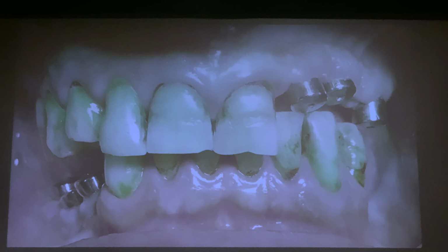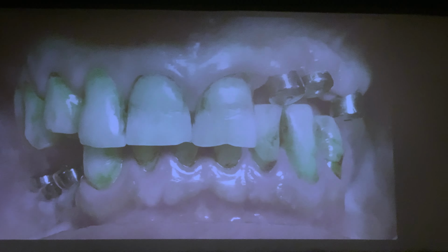This case is one of the cases that we worked on in the postgraduate clinic of the conservative department, me with my supervisor, Dr. Manhal Abdulrahman. The patient attended the clinic at 57 years old, complaining of aesthetic and functional problems, and the patient had already placed dental implants, only the fixtures, outside the college, inside a private clinic. We can see this clearly on the drafted photo. He put 8 implants in the posterior and anterior area.